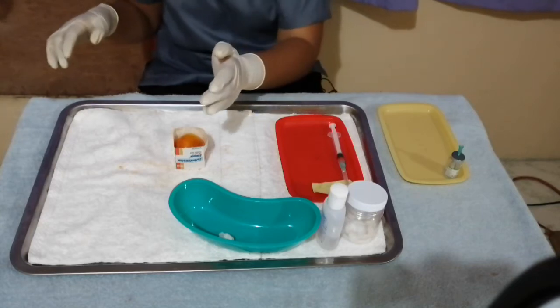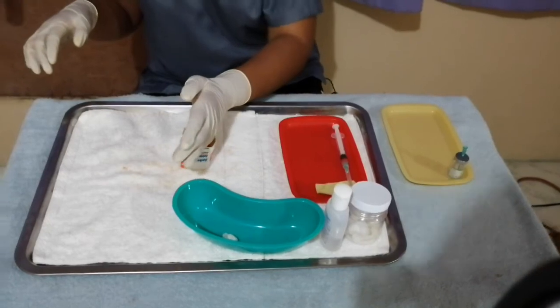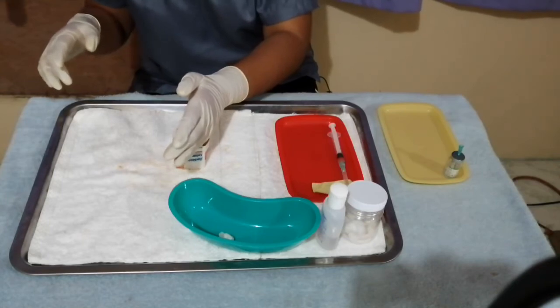So we have here the non-dominant hand. We're going to gently but firmly use it to pull the skin.